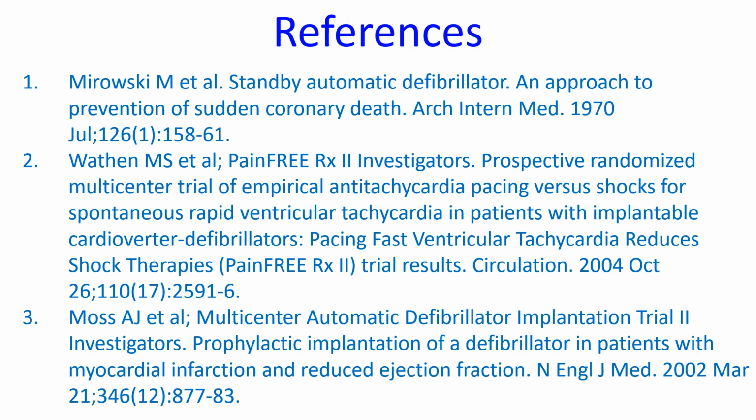Precautions with electromagnetic radiation and magnetic resonance imaging are applicable to ICDs like pacemakers. This is only a brief overview about ICDs as the topic is very vast with so many ramifications. Here are a few journal references.